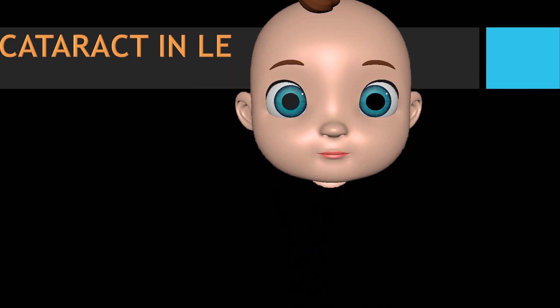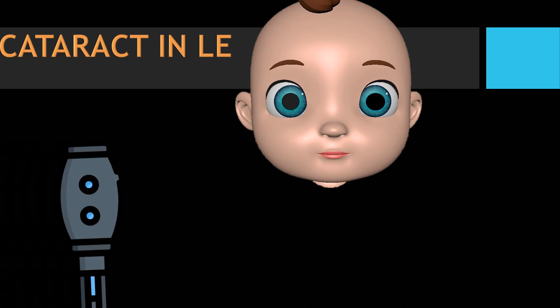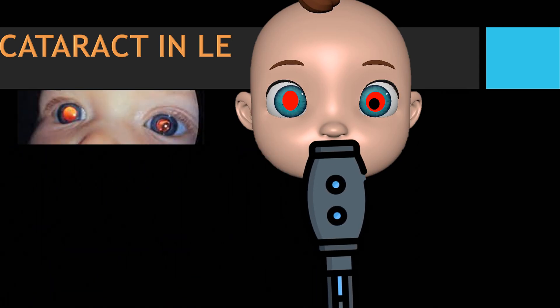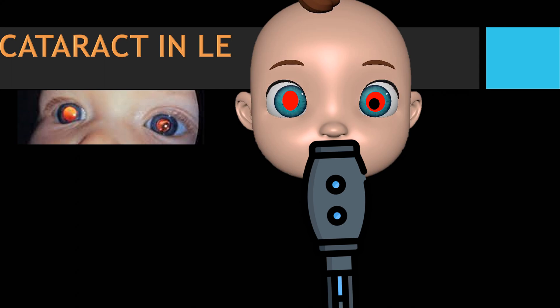If you are looking at a cataractous eye and shine the light, we see a shadow, which is an indication of media opacity. This gives a clue that the child has some media opacity which needs further investigation.